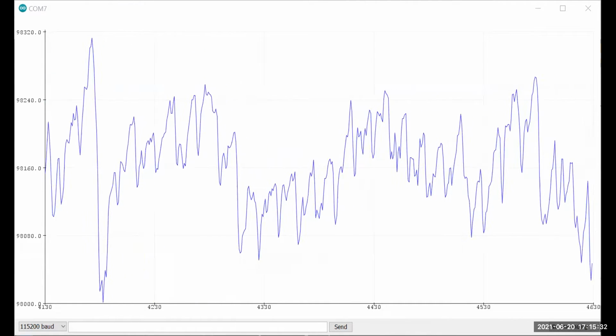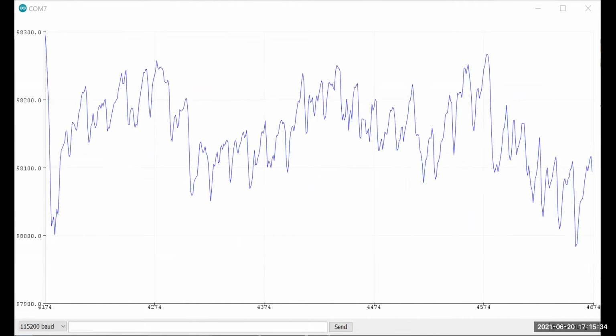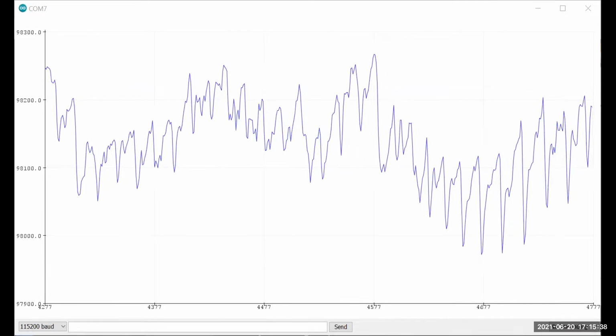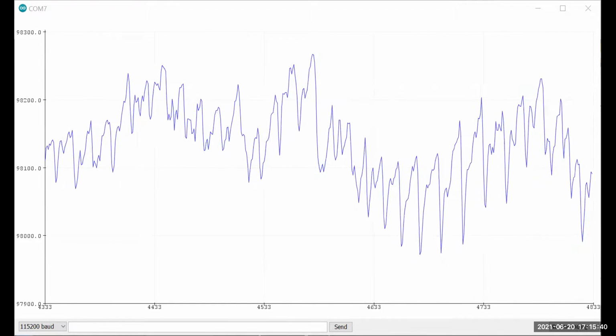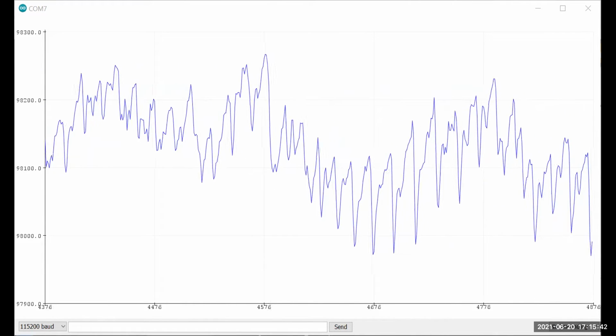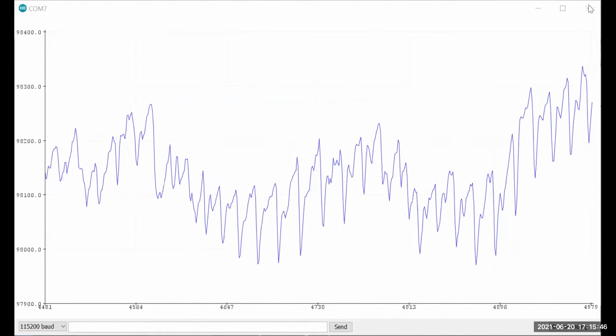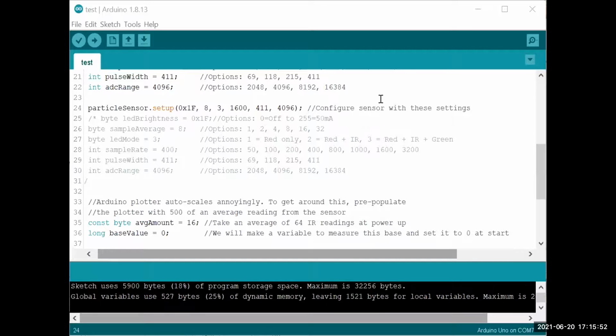This is using infrared light. So right when my heart pumps, that rapid shift down is happening. Our nursing staff will talk about why that happens later this week. So that's what we have as far as the output, what it looks like. Now let's go ahead and look at what code looks like, and I'm going to talk about that.